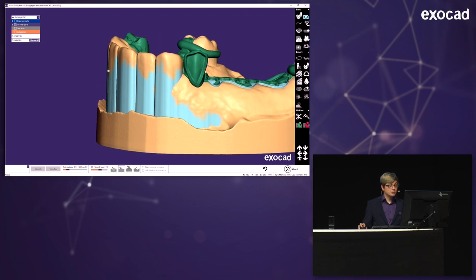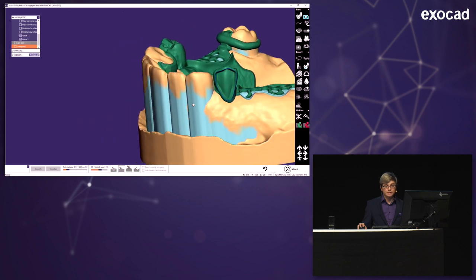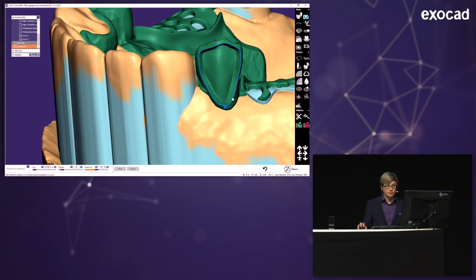And what you can do now, if you start searching here, there are all the curves I designed before. I can just activate them again so I see them again. And I can reuse them for other functionalities like retention beads. Just click on the curve, click on apply. And there are retention beads there.